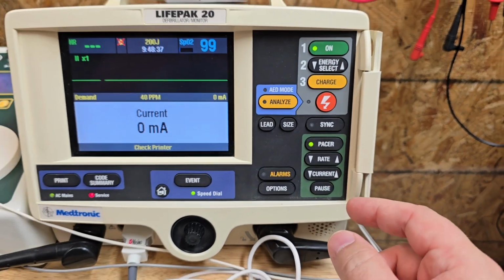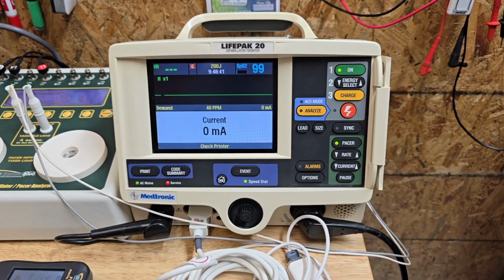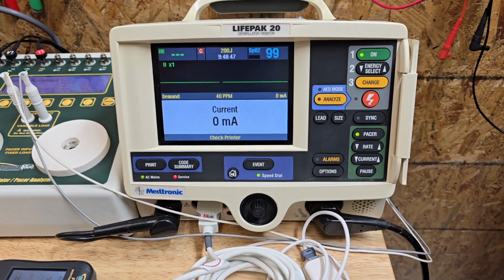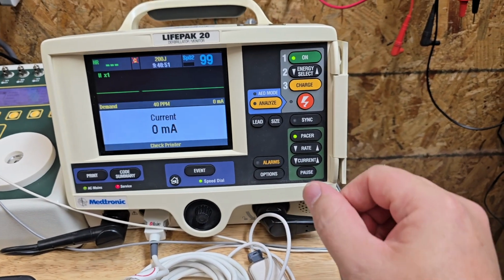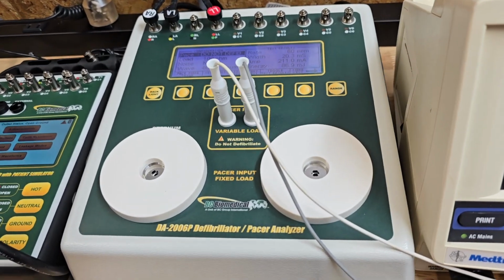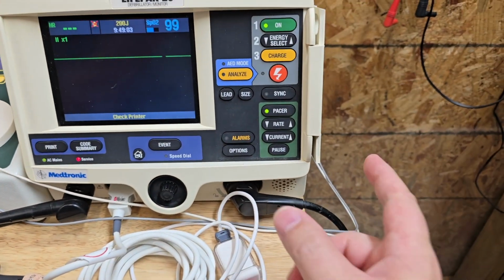The current is going to be based on the anatomy of the patient, because sometimes patients are rather large and you have to up that current because you want to inject that current across the cavity of the heart in order to stimulate it to pulse. It's kind of like a TENS unit stimulating a muscle, but we're doing it under a very regulated setting. And that is why we need a defibrillator analyzer that can monitor and measure pacing.